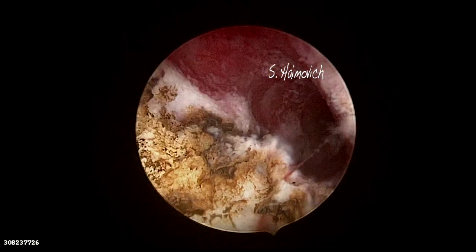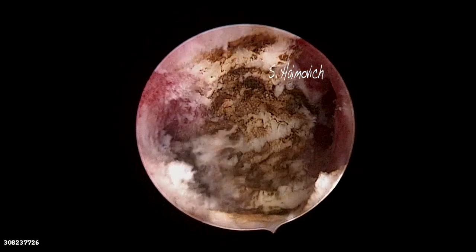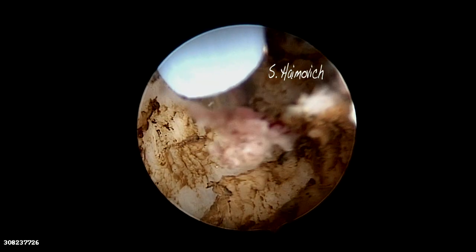In this kind of thick septum, we arrive to a point where there is also a myometrial component, and then the patient starts to feel pain. In our case, in order to avoid the pain, we use local anesthesia with a Williams needle, 34 centimeters long, through the scope working channel. We applied lidocaine 2% to the septum.